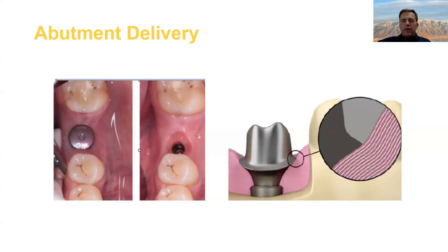And this is something that I think most of you know, but I want to mention it. A person shouldn't be able to feel anything through their dental implant. If they're actually feeling pain in the implant, that probably means the implant's failing. So I would discontinue whatever prosthetic treatments I'm doing at that point. Go ahead and get them into the surgeon and get that case reviewed. There's probably some not so awesome things going on.